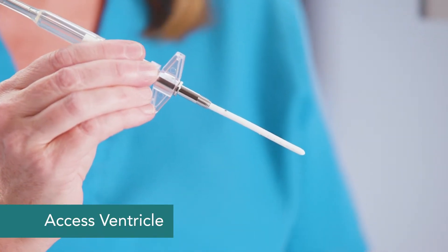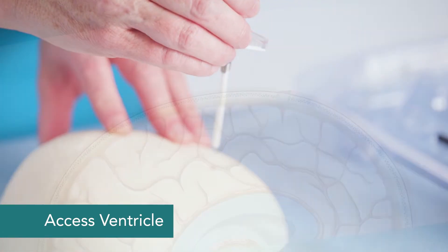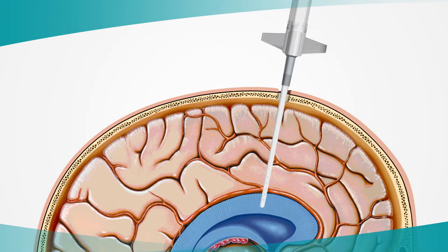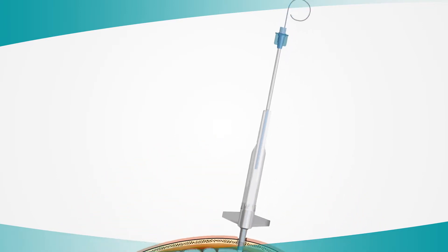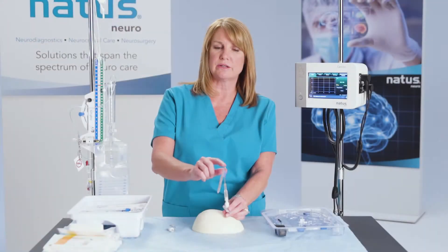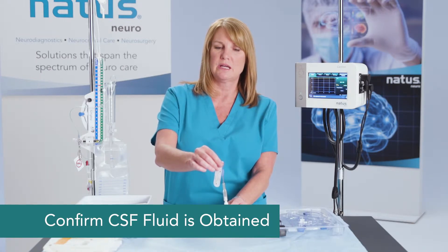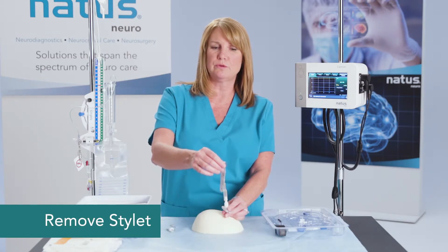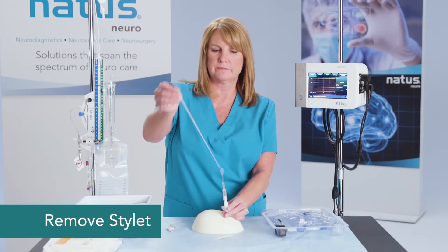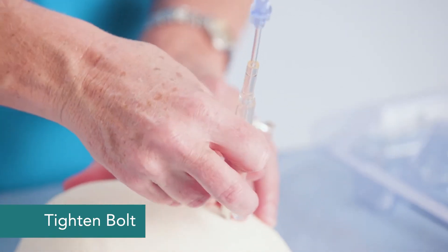Now I'm going to access the ventricle through the burr hole. I need to make sure I have the correct trajectory. Where I'm going to look for CSF fluid will be at the back of the stylet — I should be able to see it there. Once I know I have CSF, I can remove my stylet and tighten the bolt into the skull.